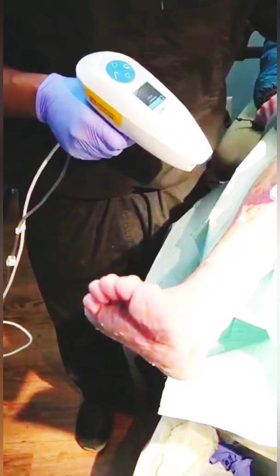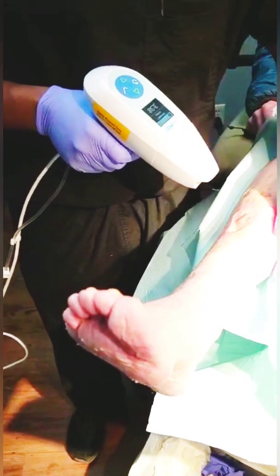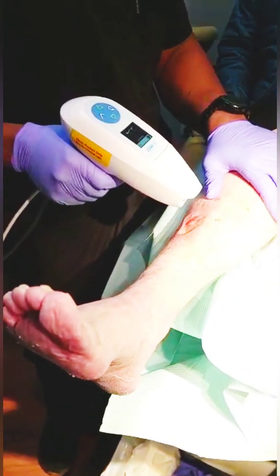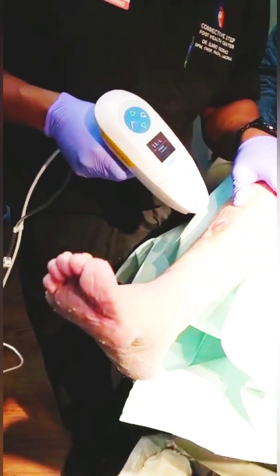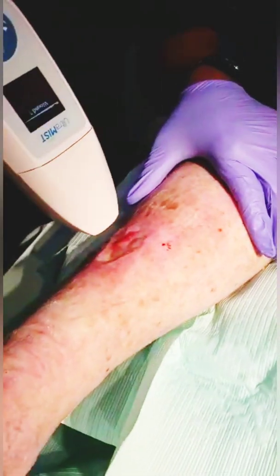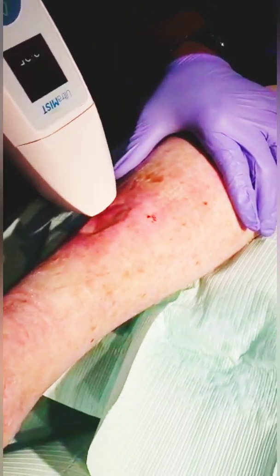Interestingly, the timer is counting down as well, so that's probably included in the therapy time. It's just about three to five minutes of treatment and then we'll probably see some dripping — and there's the misting. Oh, it's starting!